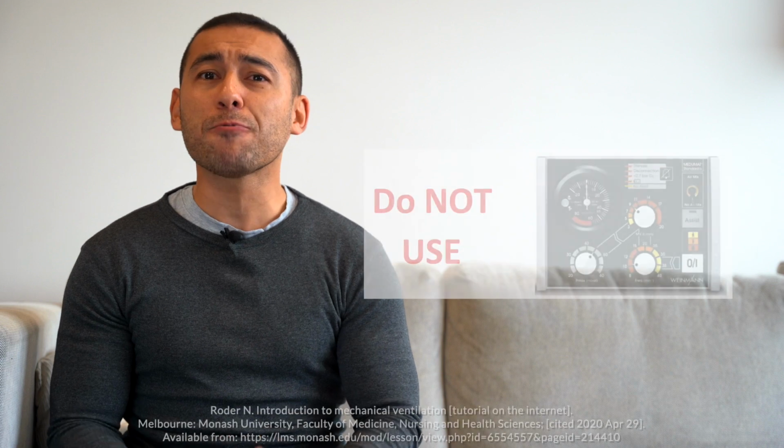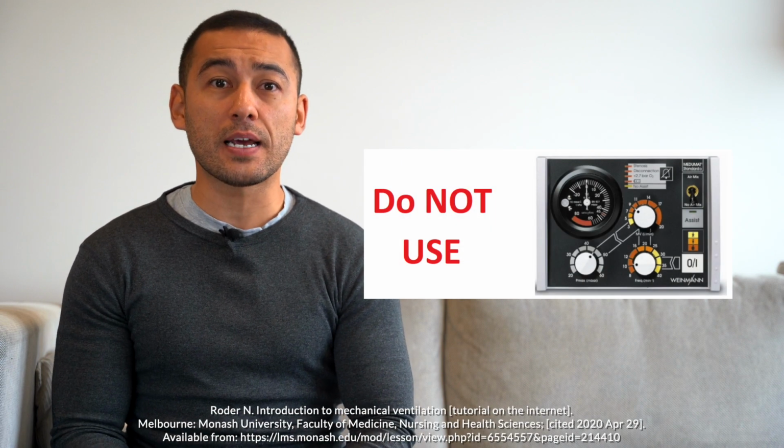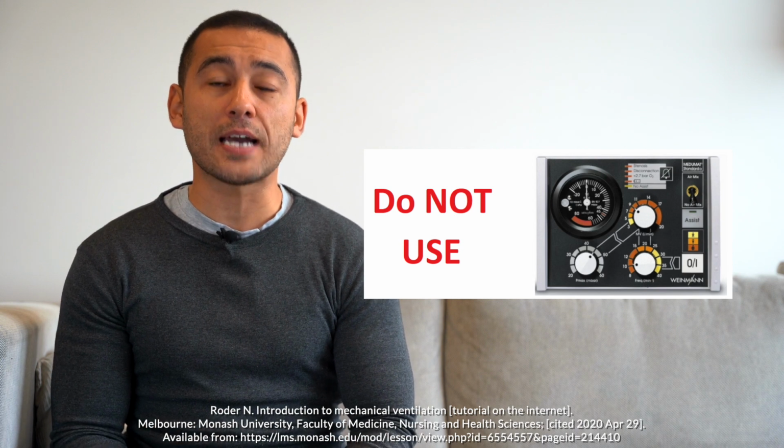As the internal diameter of the plastic cannula is only 4 millimeters, a slightly higher inspiratory pressure using the BVM may be required when delivering the 6 to 7 mL a kilo tidal volume. It is important to note that in AV, MICA paramedics must continue to manually ventilate the patient via a BVM and refrain from switching to a mechanical ventilator. The Medumat mechanical ventilator is not suitable for use with cricothyroidotomies and has therefore been listed as a contraindication by AV.